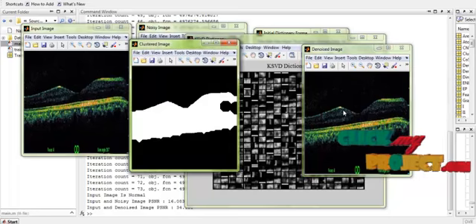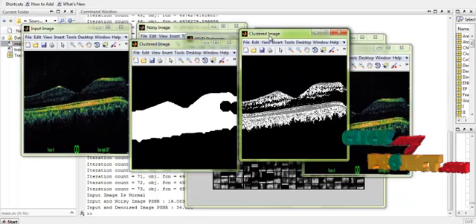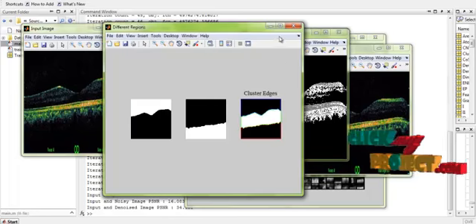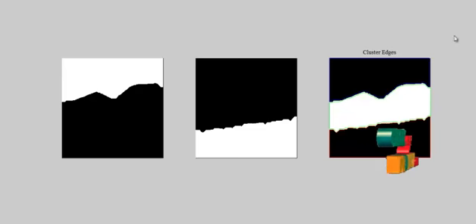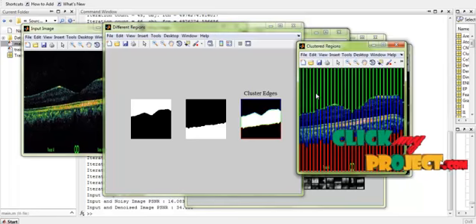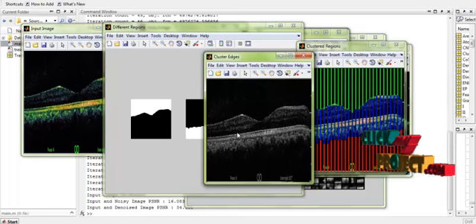This is the overall clustered region in the input image. From this, we separate the input image into several regions. So this represents the several separate regions in the input images. The clustered edge regions were displayed in the images. Hence, we have identified the exact edges of the input images. So this is the separate regions identified. As a result of the clustering process, we separate the input images into several regions.